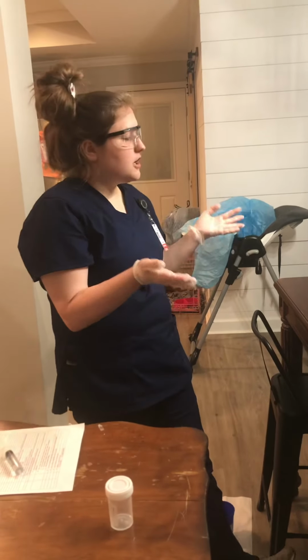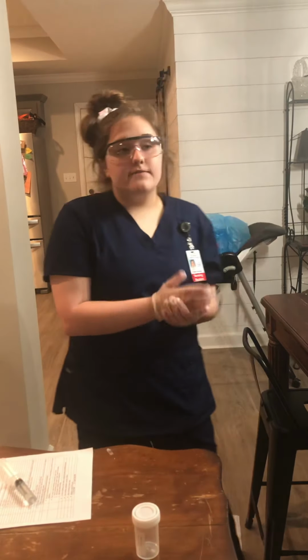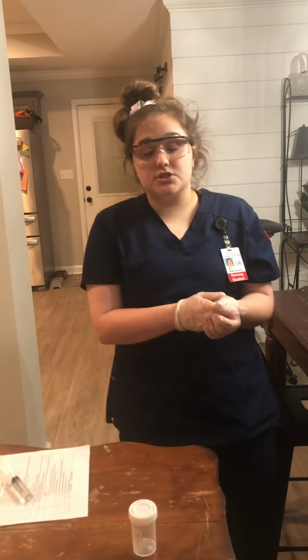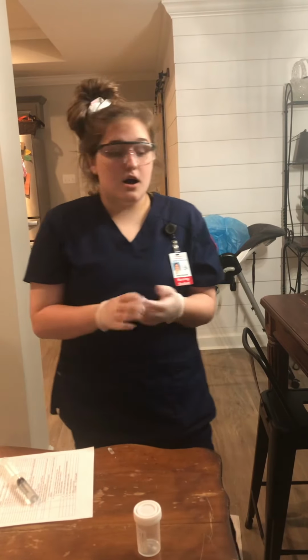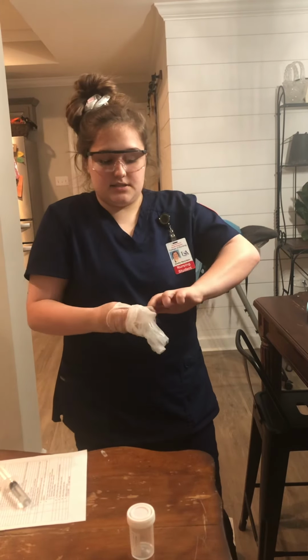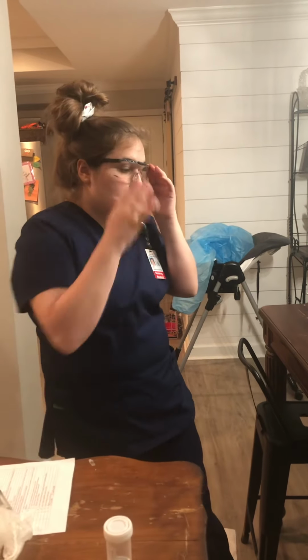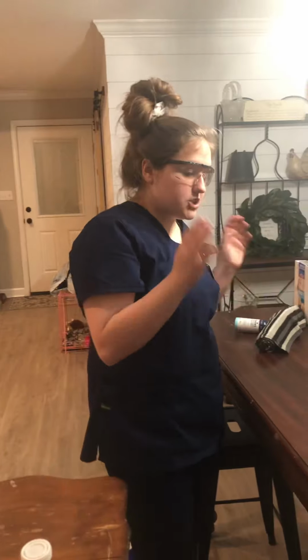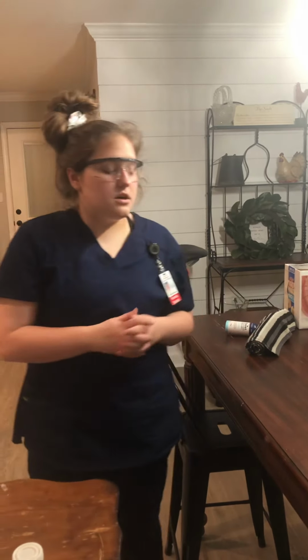So after I took my catheter out, I would come back to my patient and check in 4 to 6 hours afterwards, and if they had not voided, I would palpate their bladder or do a bladder scan. And yeah, I would remove my gloves, I would assist the patient to a comfortable position, lower my bed, raise my 3 out of my 4 side rails, leave the call light with them, and that is the end of my catheter insertion.